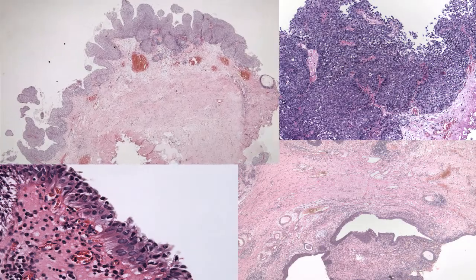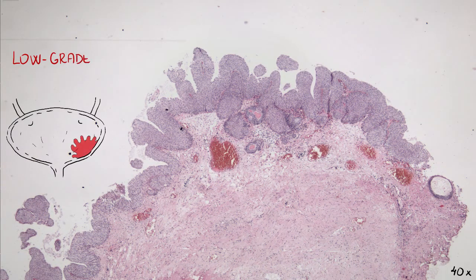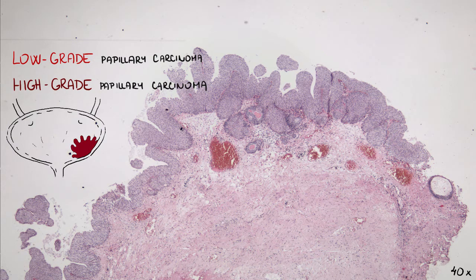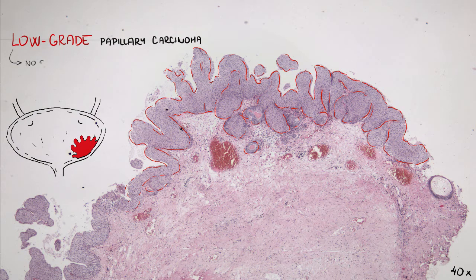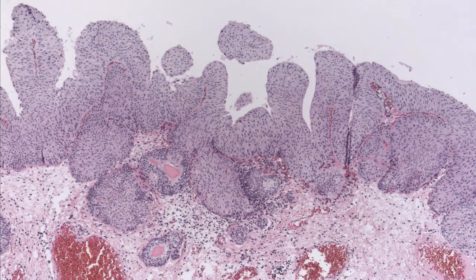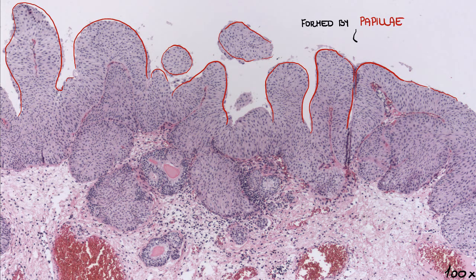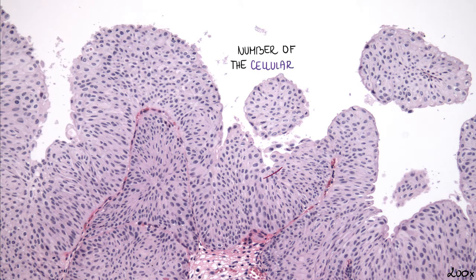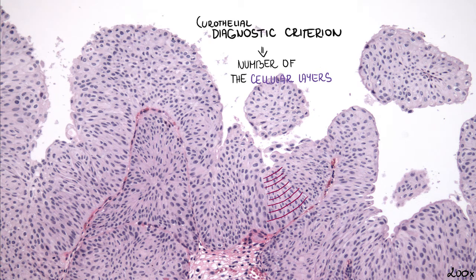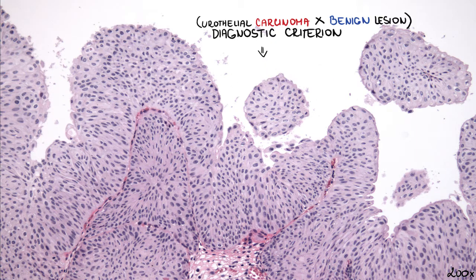Now let's discuss the microscopic appearance. First, we need to stress that both low-grade and high-grade papillary carcinomas, despite being called carcinomas, are non-invasive in situ lesions. On the picture, you can see low-grade papillary carcinoma with no signs of invasive growth. The border between epithelium and stroma is smooth, and the basement membrane is intact. This type of urothelial carcinoma is formed by papillae covered by several layers of urothelial cells. Previously, the number of cellular layers was a diagnostic criterion for distinguishing urothelial carcinoma from benign lesions, but this criterion is no longer valid. Nowadays, urothelial carcinoma is recognized according to the presence of cytological and architectural atypia.